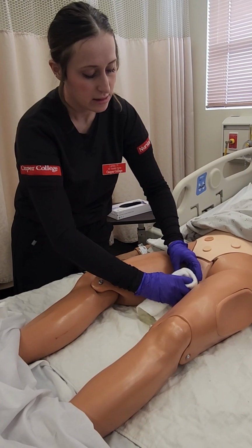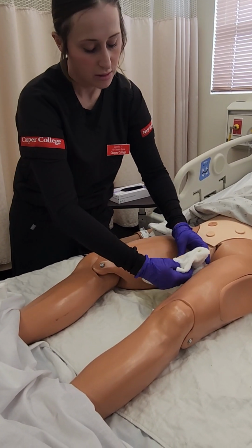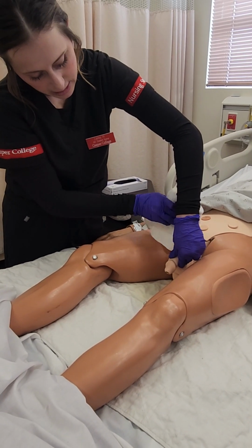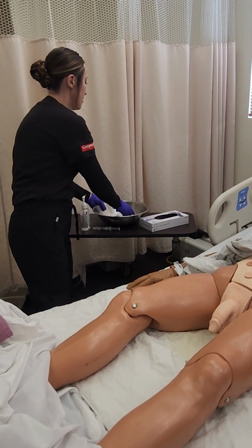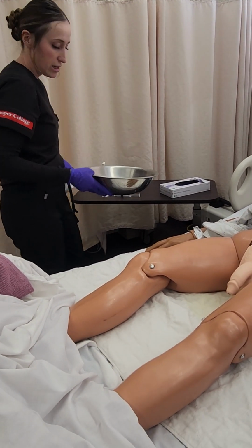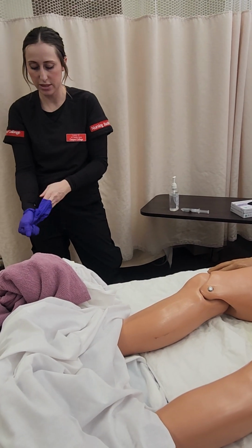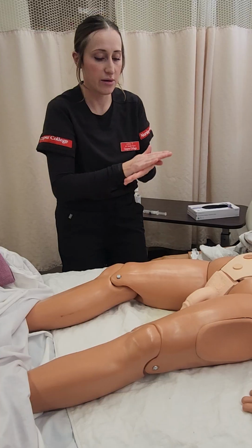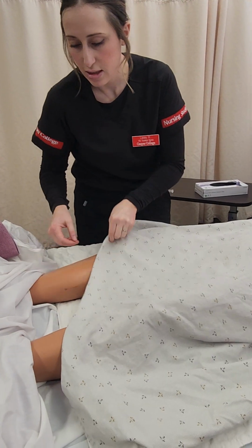Just clean. Always check in for any mucus, skin breakdown, anything abnormal. All right, so I'm gonna put this in my laundry, wash this, put this away, dispose of my gloves, hand hygiene again. All right, I'm gonna cover you back up. Okay. Again, I'll be back here shortly to change that chuck.